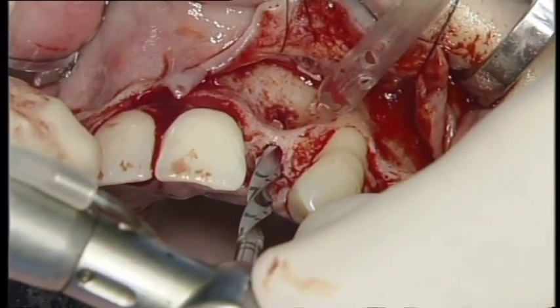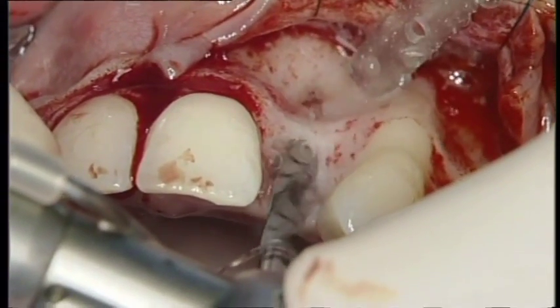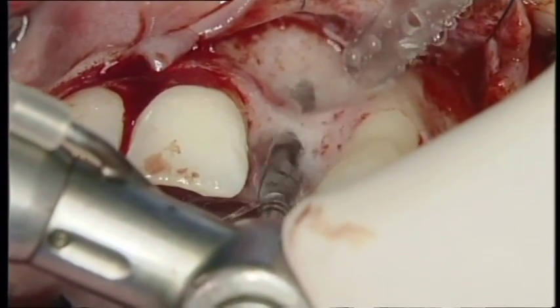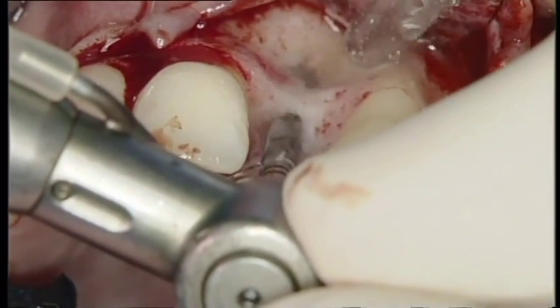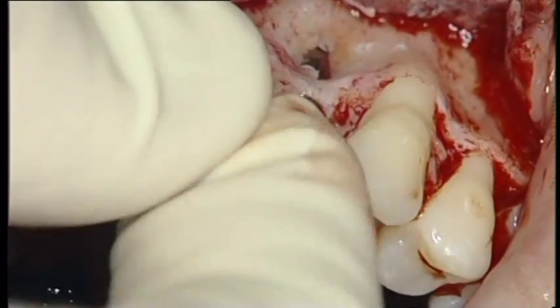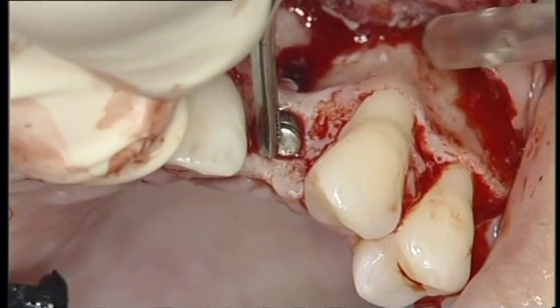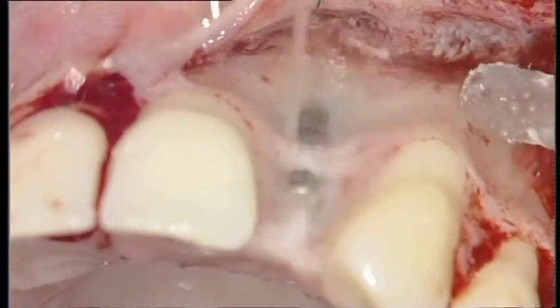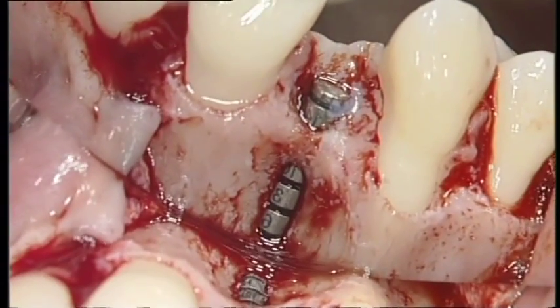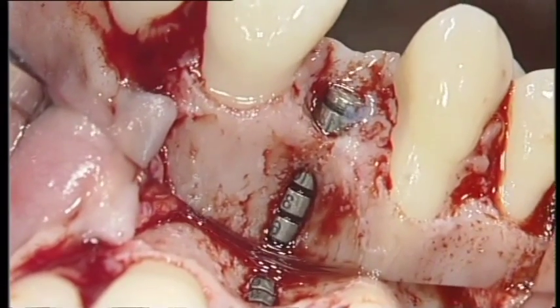Then the second 2.8 millimeter spiral drill is used to widen the implant bed preparation, using copious irrigation with chilled saline. A cut-off 2.8 millimeter depth gauge is inserted to confirm the direction and sink depth. Both are appropriate for a 3.3 millimeter bone-level implant to be inserted in a correct three-dimensional position. After irrigation with sterile saline, the mirror view shows the prepared depth to be approximately 14 millimeters.